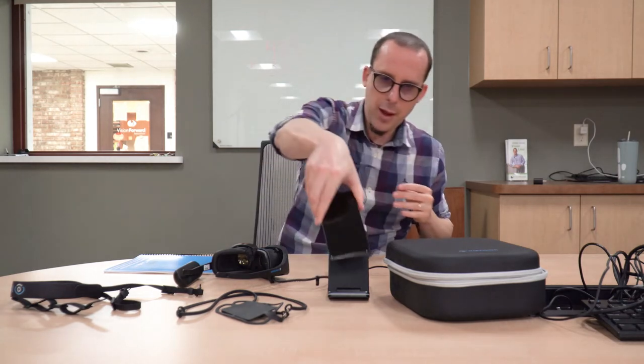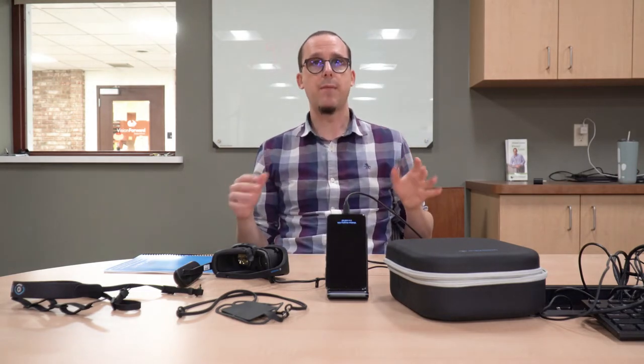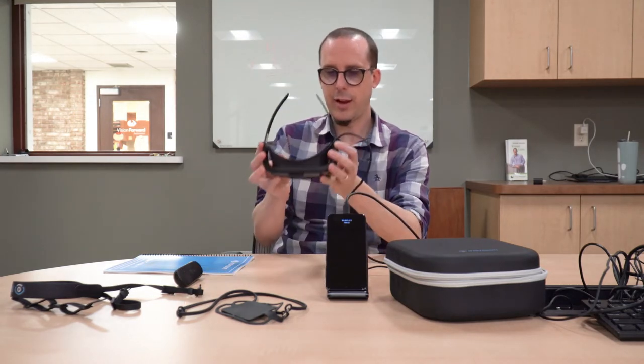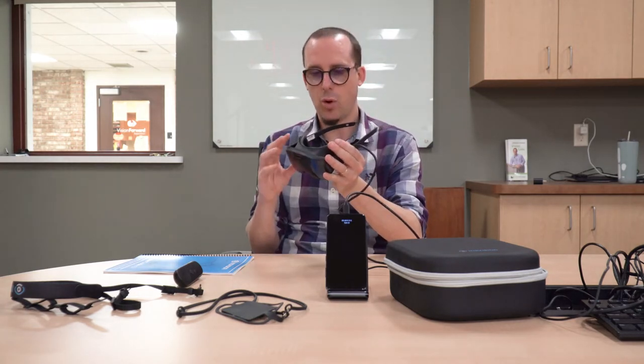Being tethered may be a downside to some - whereas with the IrisVision Live, everything is built into the headset. But the upside is that they have managed to make the headset itself very lightweight because it hasn't got all of the computing innards in there anymore. So it's a really nice lightweight headset, which makes it super comfortable to use and also allows them to make it smaller. I think that's a good tradeoff.